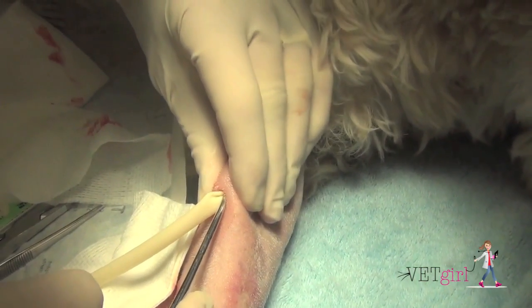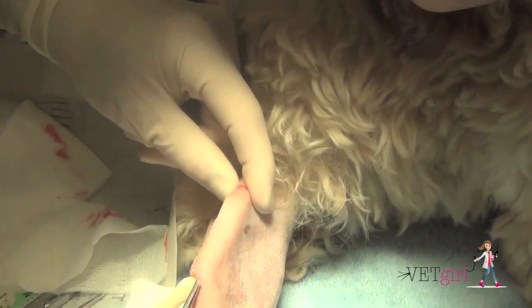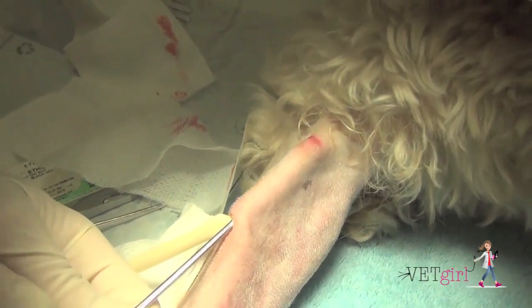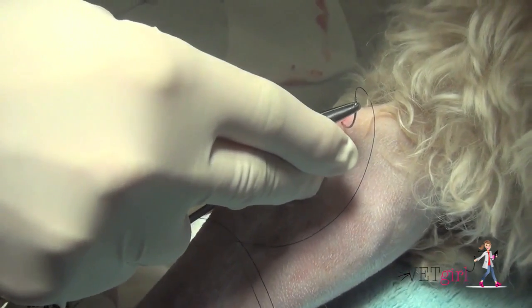We want to place a drain that will keep the opening intact for two to three days, and then treat this dog on an outpatient basis with antibiotic therapy, warm compresses, and recheck two to three days later for drain removal.